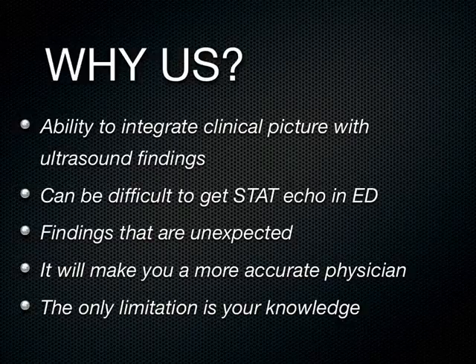And so this was an undifferentiated patient. The medical student just happened to be scanning, going bed to bed, and picked that up 2 days ago. Would that have been discovered with a thorough history and physical? Yeah, maybe, maybe not. Maybe it would have been delayed for a few hours, but the patient immediately went and had this procedure done 2 days ago.